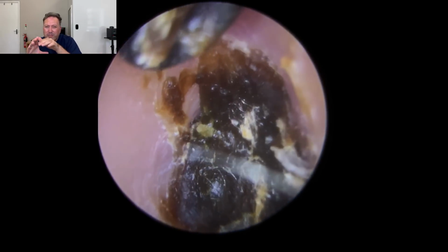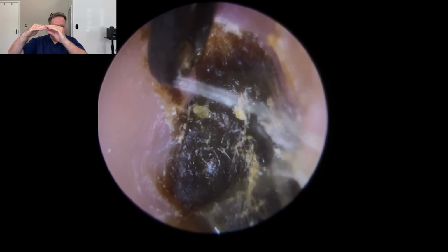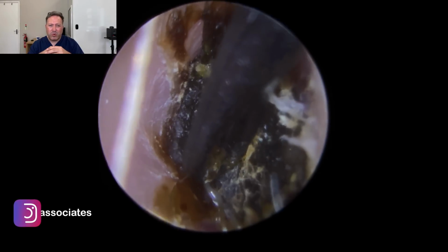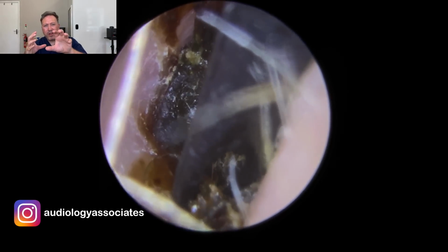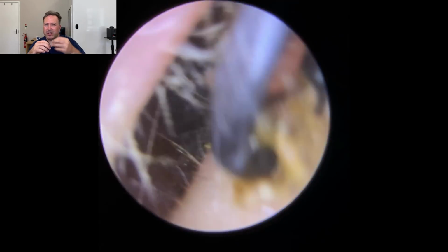We've got a kind of a blunter edge, if you like, which is going to be probably a little bit thicker than this tapered edge we have at the moment. But you can see even with the Jobson horn, trying to find an edge to work with that doesn't push this depressed section further in is proving difficult to do. So I'm just nipping a couple of these little edges off.